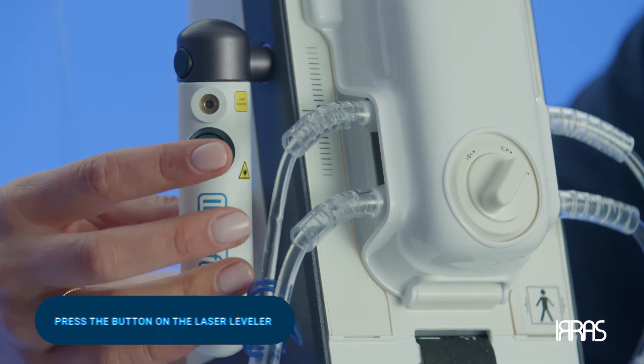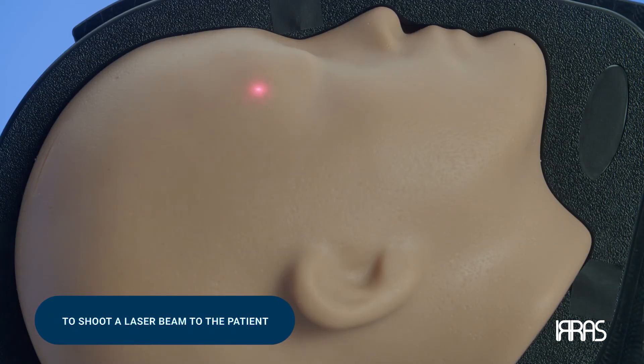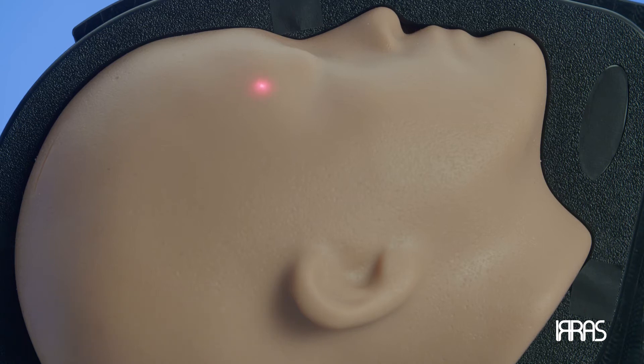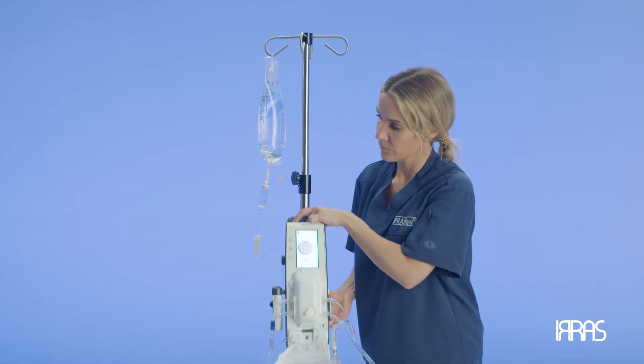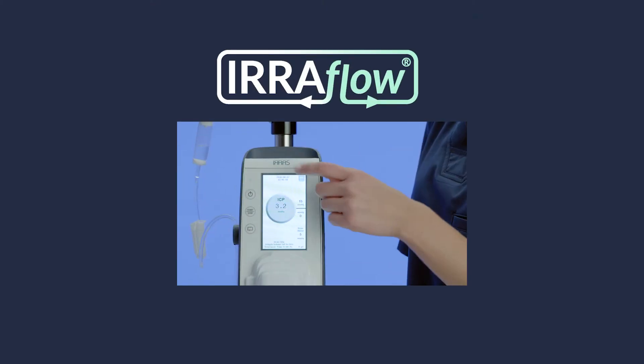To do this, press the button on the laser leveler to shoot a laser beam over to the patient. This will allow you to visually see where the control unit needs to be positioned. Typically, the zero point of the control unit is adjusted to the tragus or top of the eyebrow.